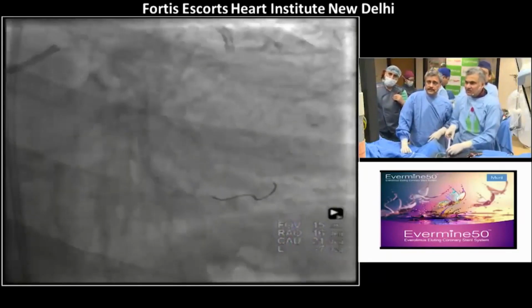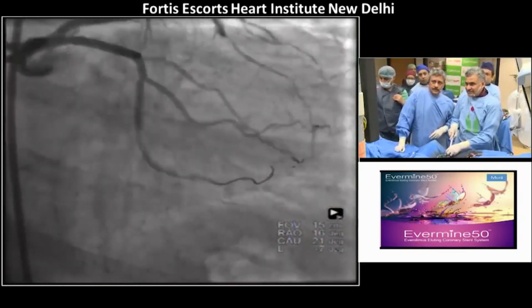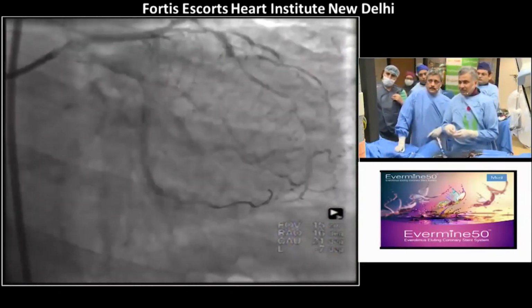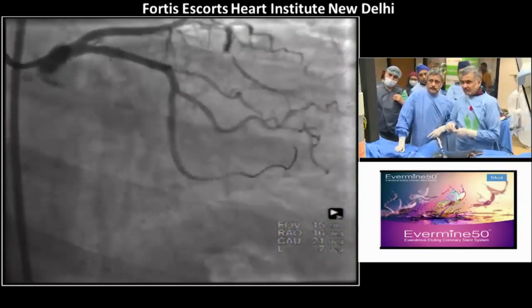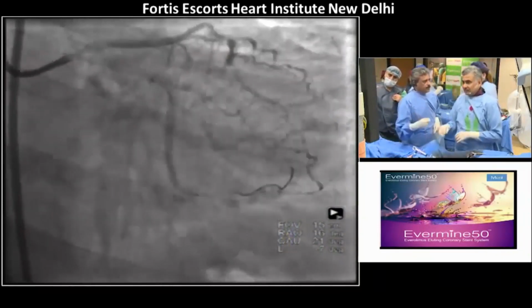That's a haziness there. You think that's a little tissue prolapse still over there? Hazy. Well, you'll have to look by IVUS. This is the only area that we are concerned about. Yes. So first we'll do a 2.5 with this stent and then put in an IVUS.